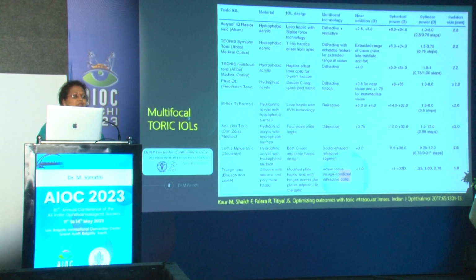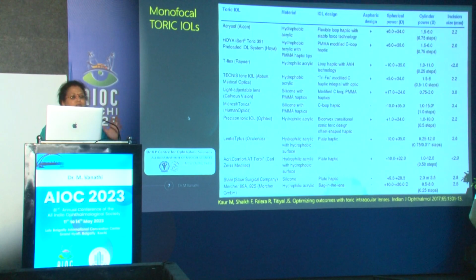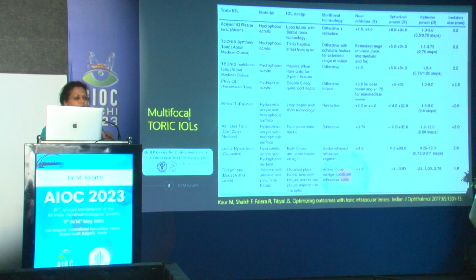The same when you look at multifocal IOLs, but largely now the current trend or practice pattern is that you've moved on from using multifocals to using a higher quantum of trifocal IOLs, or adapting a larger amount of trifocal torics in your practice here. So that's what you need to look at. Again, what you need to know when you're doing monofocal torics and you're doing trifocal torics is the quantum of astigmatism you want in. Normally, if you have the virgin corneal astigmatism of more than 1.2 is what's going to be your borderline when you're considering toric IOL implantation.